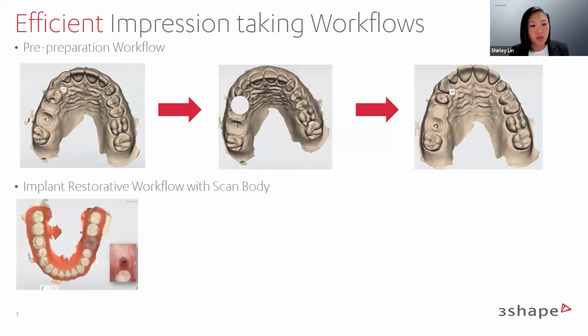Now, another workflow that I would think is also great with digital is your implant restorative workflow with your scan bodies. So there's no open trays anymore. There's no drilling of the trays. And again, your PVS impressions, especially with implants, can really get wedged into the patient's mouth and create that discomfort.